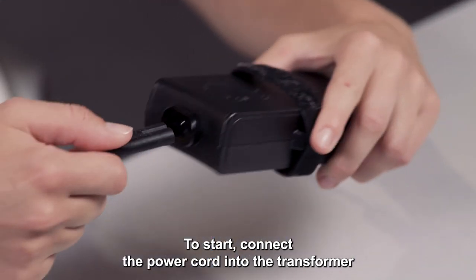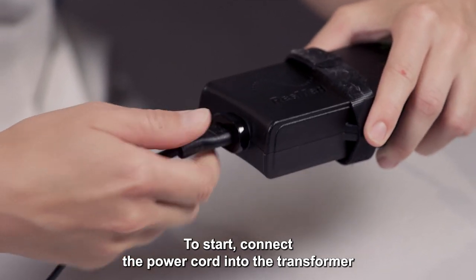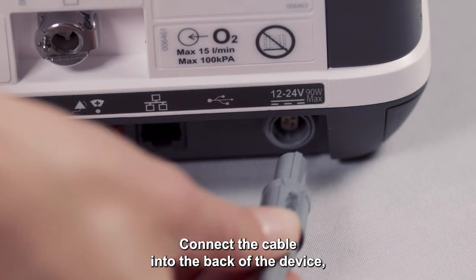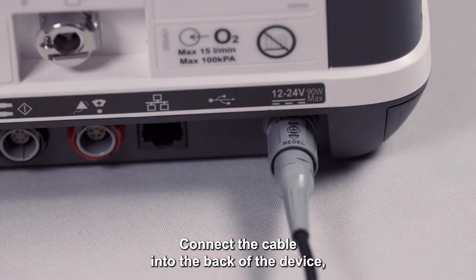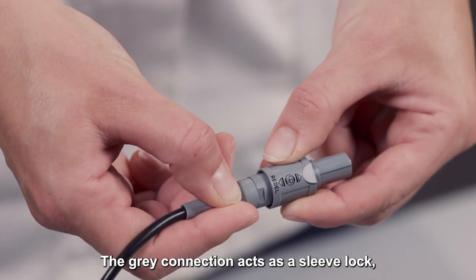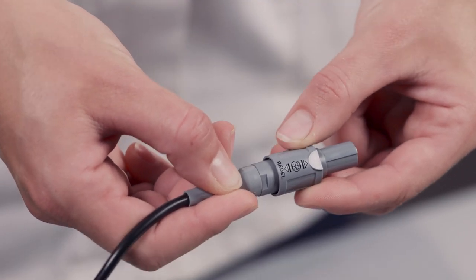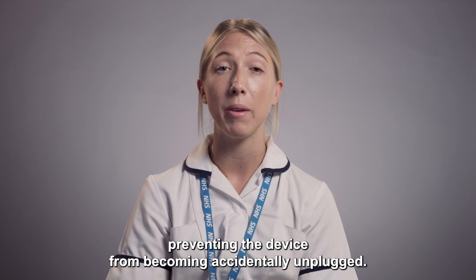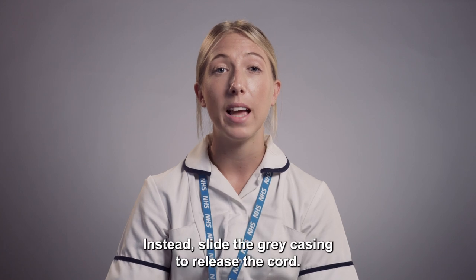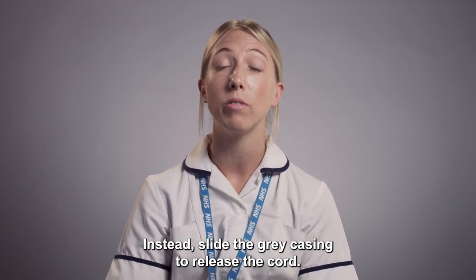To start, connect the power cord into the transformer and then into an electrical power outlet. Connect the cable into the back of the device, ensuring the arrows line up and click into place. The grey connection acts as a sleeve lock, preventing the device from becoming accidentally unplugged. Avoid pulling on the black cable. Instead, slide the grey casing to release the cord.